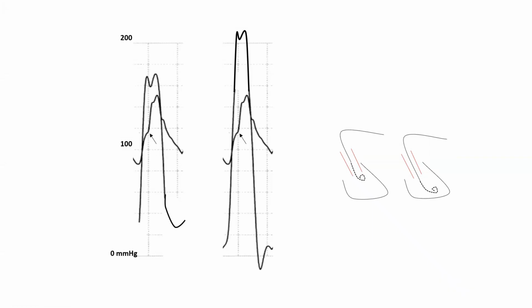It's not an error in damping. You are correct, because the tracings look nice with nice dips and valleys. But it suggests another sort of error. The more common error would be error in zeroing, meaning the two transducers were zeroed not at the same level. So you re-zero your system, both transducers. If that doesn't correct it, then think of that third error. That's your sequence of events.